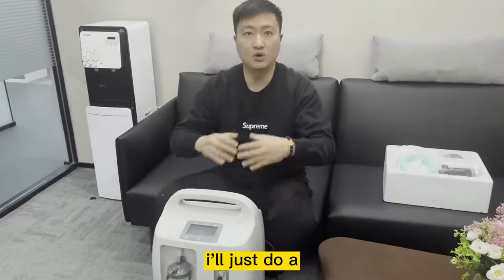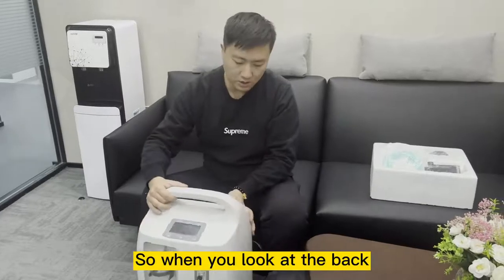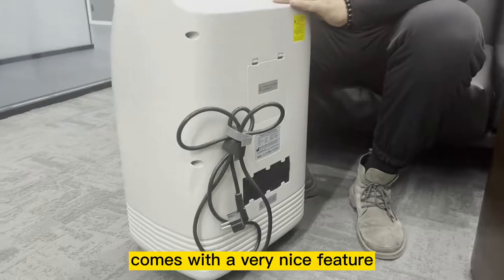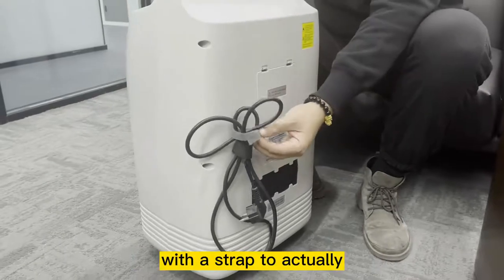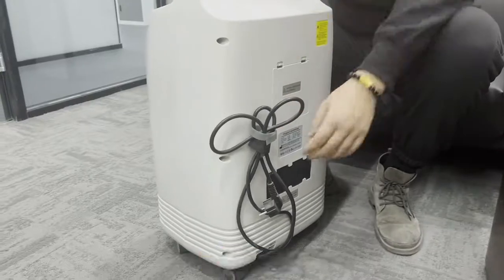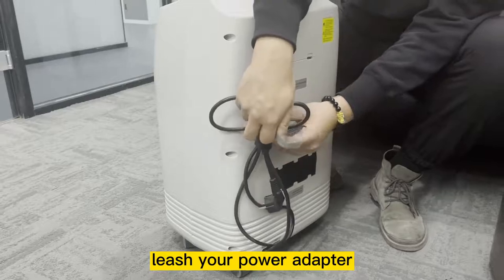Next, I'll do a simple demonstration of how to operate this machine. When you look at the back, our ORV10S comes with very nice features. It comes with a strap to hold the power adapter. While not in use, you can just lift your power adapter — it's very convenient.